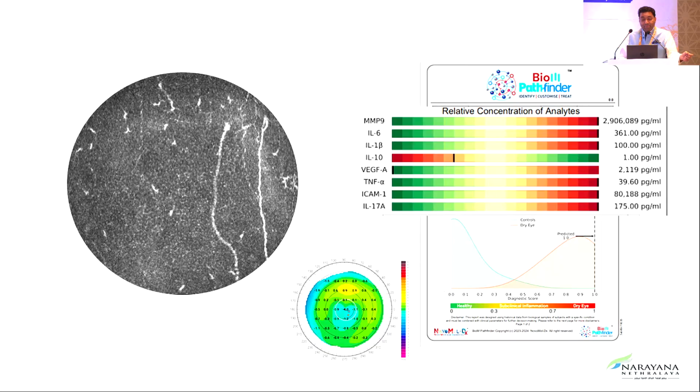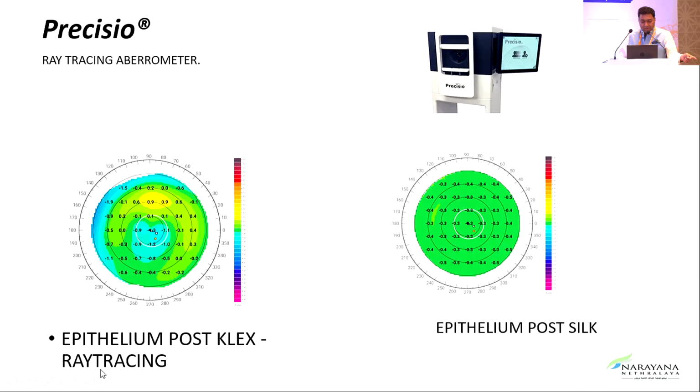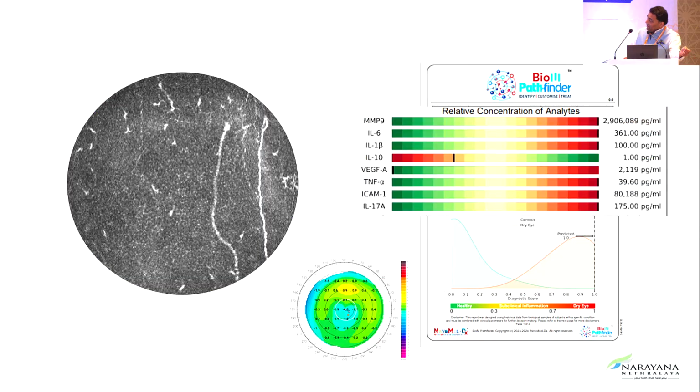And this is the same patient, the gentleman from Chandigarh. Look at this. This is his epithelium, which is irregular, and the same patient's nerve has not regenerated at all. He has got two small nerves, which end with a small microneuroma filled with T lymphocytes and a few dendritic antigen presenting cells. And look at this, biomarkers are very high. Classic sign of inflammation because of nerve regeneration leading to epithelial remodeling and the patient being unhappy.